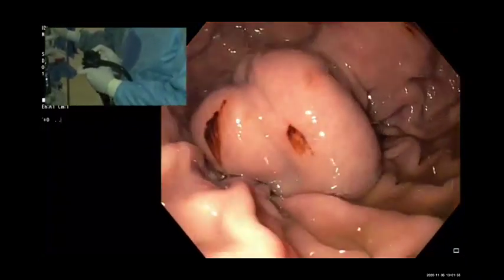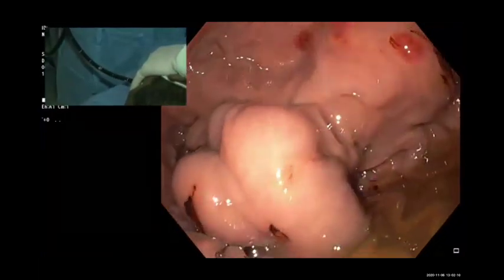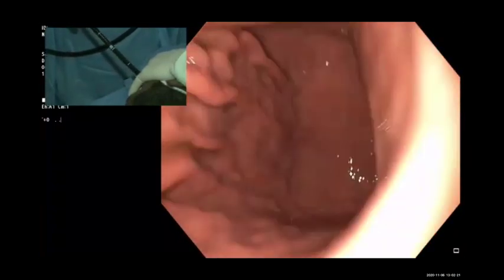And this is the large varix, which they said they have attempted, but I don't see any marker of injection here. We always discuss in detail the treatment options, because this patient is Child C cirrhosis with a history of encephalopathy. If you see such kind of varices, we change the scope to the EUS, and while changing the scope, I am going to discuss a little bit of the theoretical aspect.